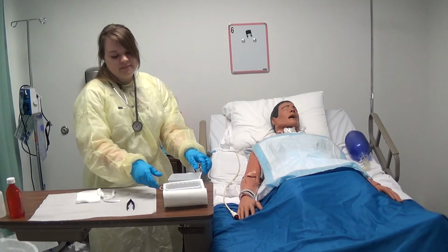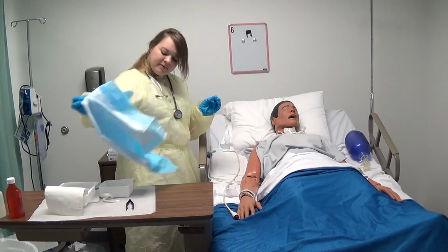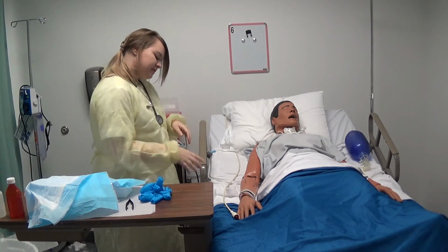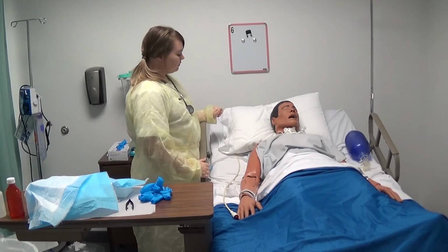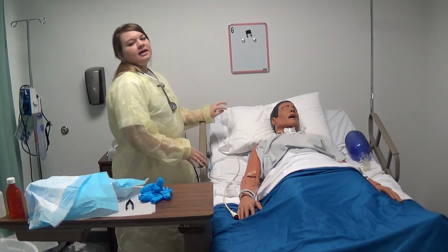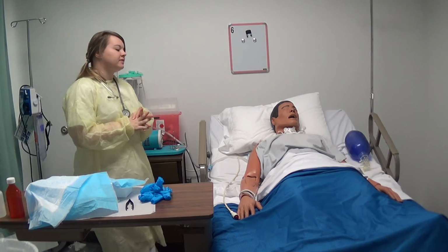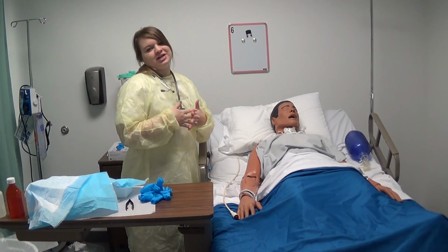I clean up my mess, make the patient comfortable, put the bed in the lowest position with the call light, and ask if he needs anything, make sure everything's okay. Then I would wash my hands, and when I leave the room, I would document how the patient tolerated the procedure and also the color, odor, amount, and type that was on his dressing.